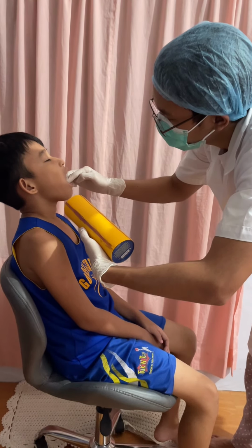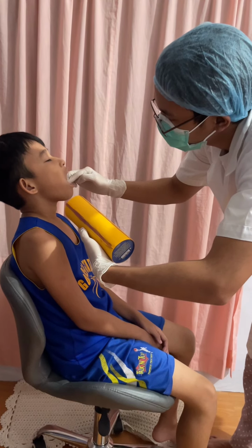Third, we will be using a different landmark. We will utilize the inner canthus for premolars.